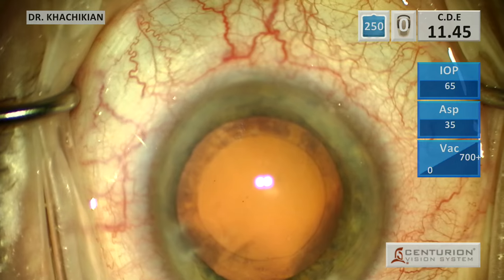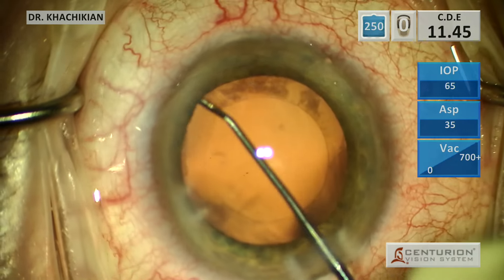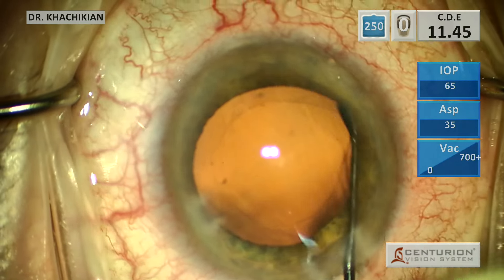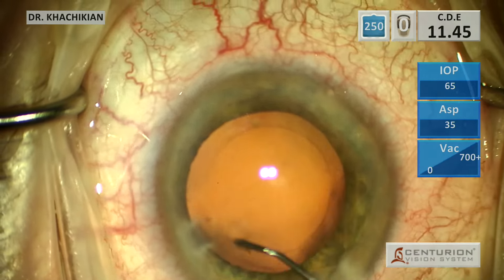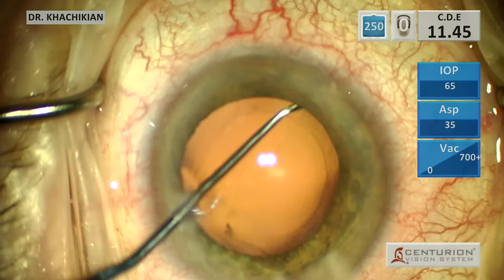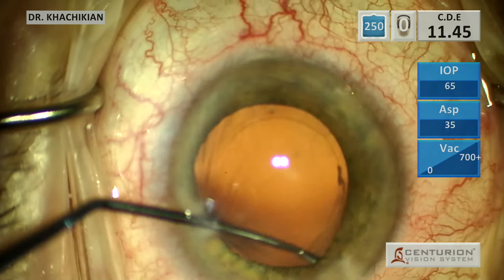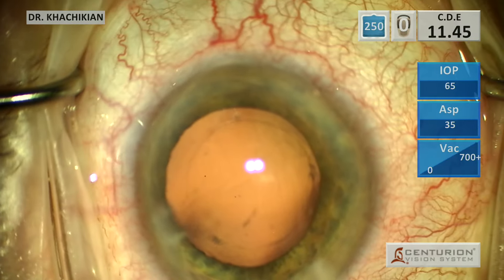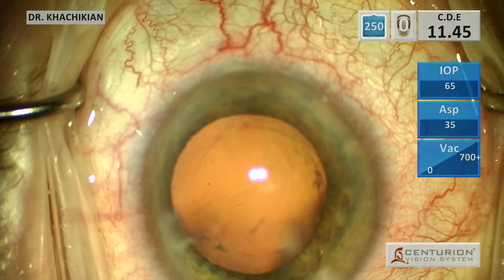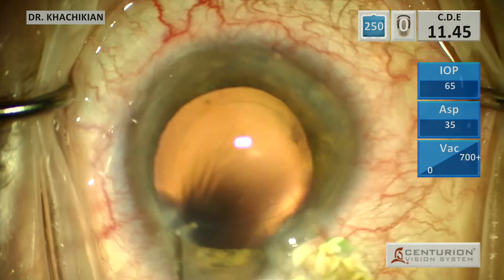So we've got a nice round capsularexis. We will use our polisher to remove some of those lens epithelial cells, just kind of clean things up a little bit, and we'll get ready to put that lens in. I like this instrument for cleaning the LECs. There's a circular sweep that I've tried to use, but you go in through the main incision for both sides and I just find it a little more difficult to use, although it might actually be better at removing the LECs.